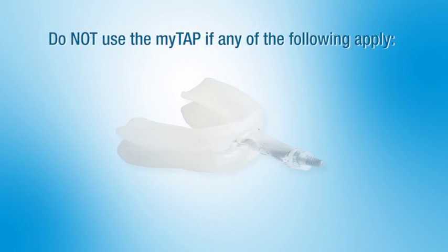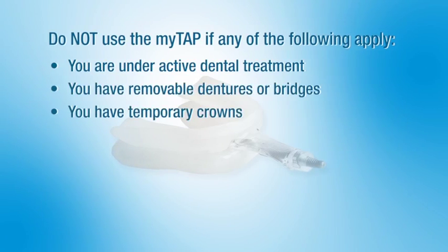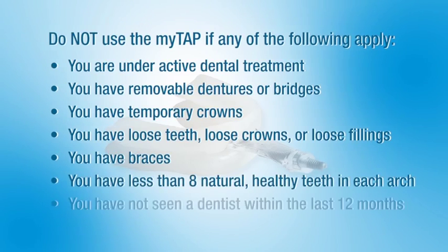Do not use the myTAP if any of the following apply. You are under active dental treatment. You have removable dentures or bridges. You have temporary crowns. You have loose teeth, loose crowns, or loose fillings. You have braces. You have less than 8 natural, healthy teeth in each arch. You have not seen a dentist within the last 12 months.